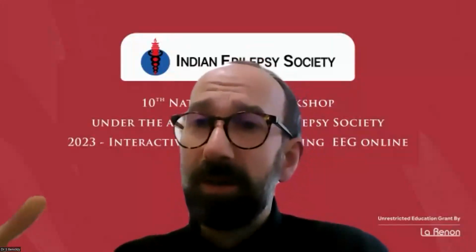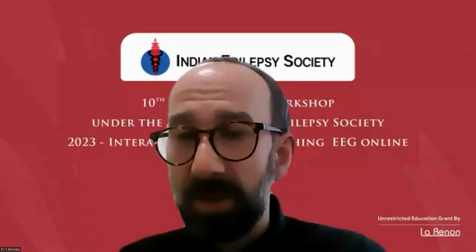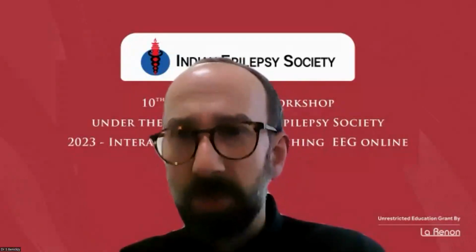Then if you are in the lower frequency spectrum, so under the 2.5 Hertz, then they don't fulfill the criteria. Then you are in, as you said, Manjari, the ictal-interictal continuum, and then you need to do some additional things to confirm that indeed it's a seizure or not a seizure, like trying, while you do the EEG recording, an intravenous anti-seizure medication.